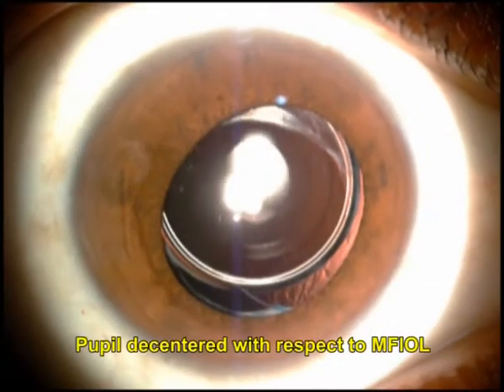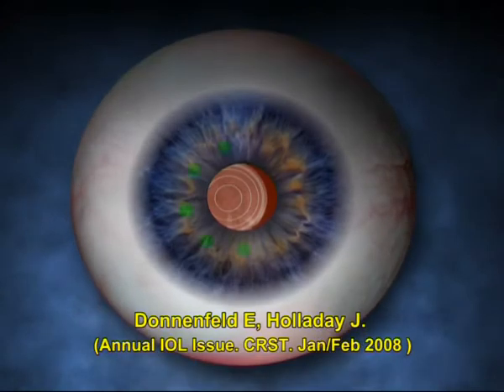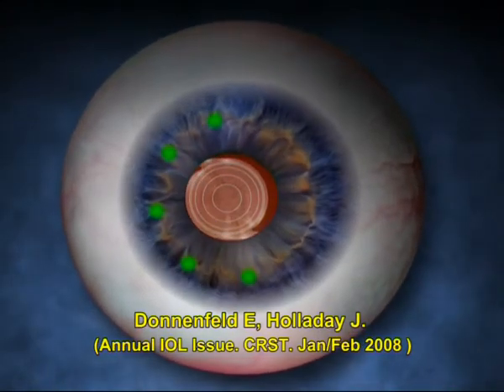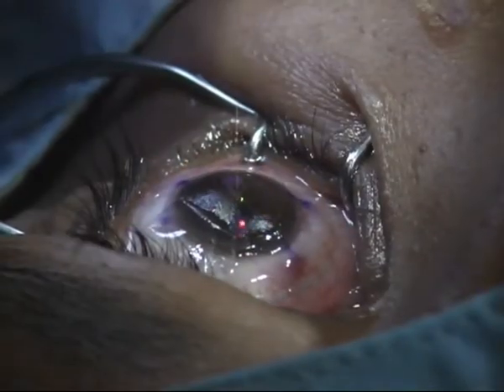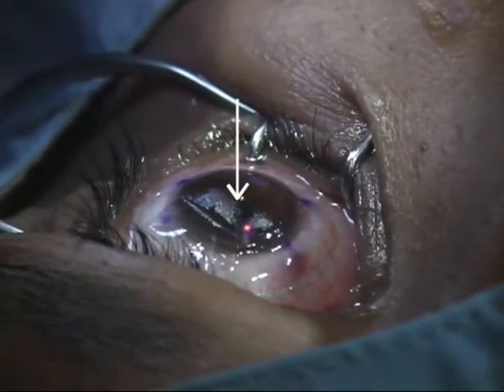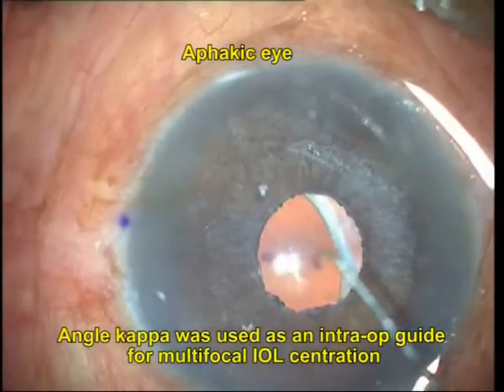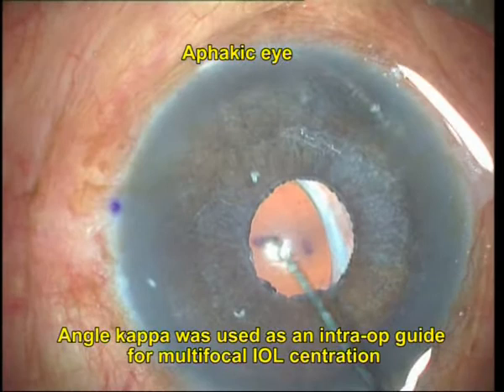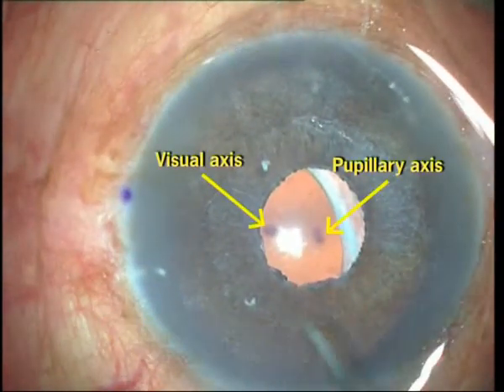Its effect on multifocal IOLs has been evaluated previously by attempting iridoplasty to make the pupil concentric to the center of the IOL. Just as the corneal intercept of the visual axis is used for centration of ablation in LASIK, we attempted to use the angle kappa measurement as an intraoperative guide to center a multifocal IOL.